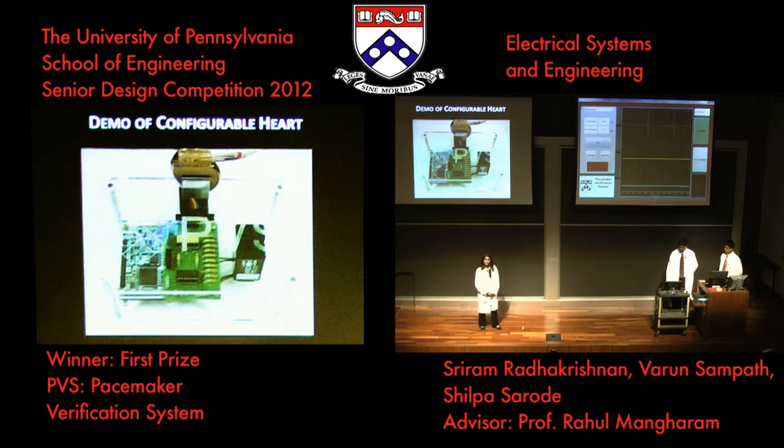What happens when the pacemaker does something that the heart doesn't want, what it shouldn't? And we're going to show such a scenario right now. This is called endless loop tachycardia. We're going to start in a situation where our heart is beating at 75 beats per minute. A normal sign is when the pacemaker doesn't have to kick in.